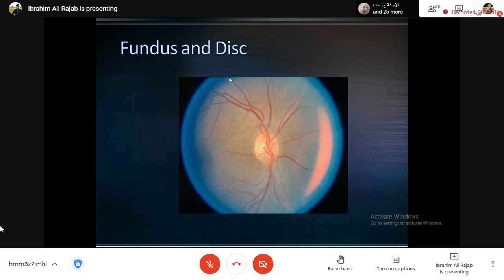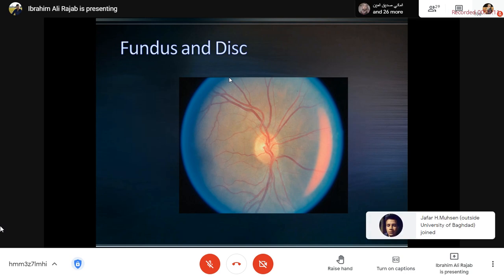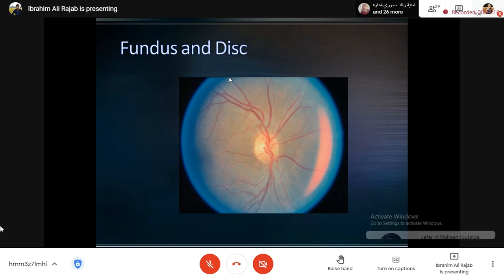والارتري smaller وبرايتر. Yes, we should know the vein and the arteries, and we should know if there is an abnormal blood vessel. This is the normal distribution.